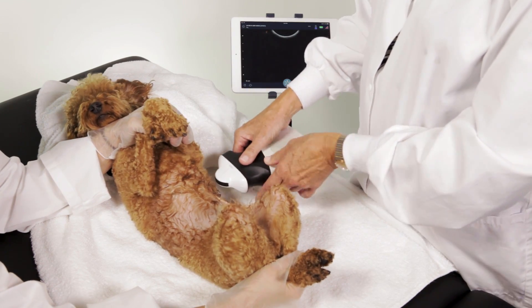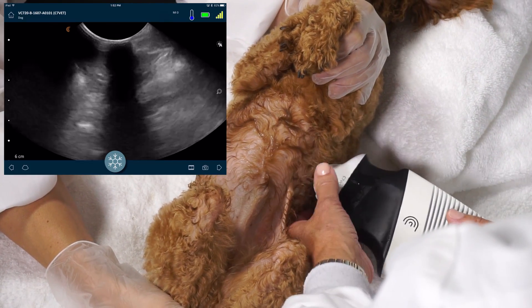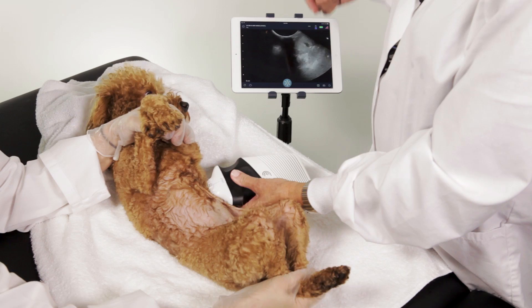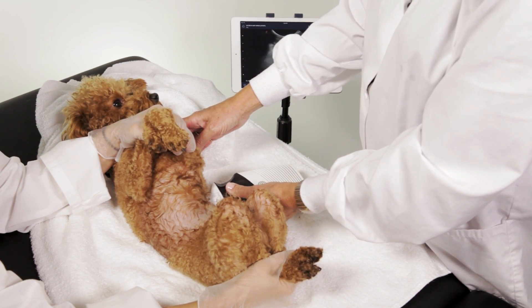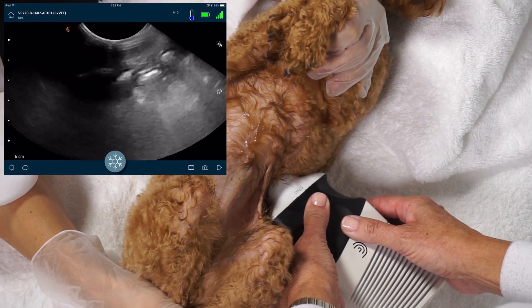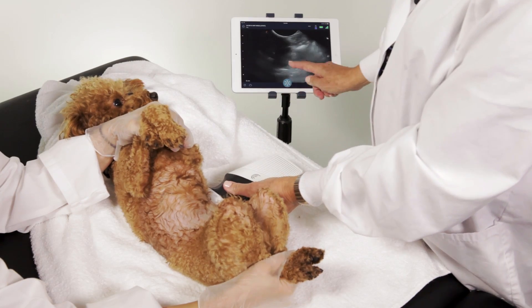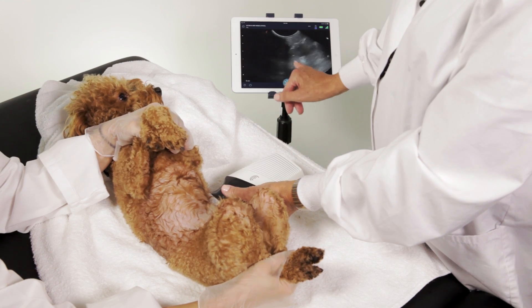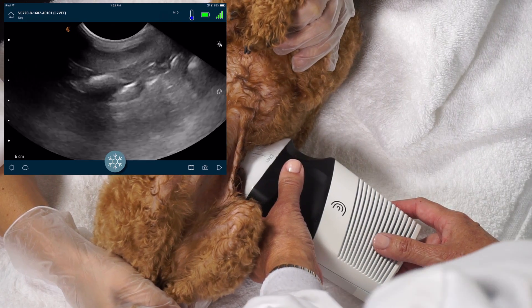The next spot we're going to go to is the splenorenal area, right here on the side. We're going to get a nice rib shadow here. We get a little bit of spleen and kidney. We're going to go all the way through from top to bottom in transverse to make sure there's no fluid hidden in that pocket, such as from a spleen rupture or something like that.